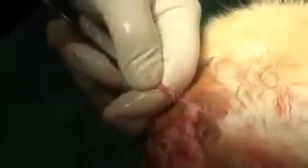And then I'll cut, and then it kind of forms the knot. This starts the starting of the knot. So then I'll cut the testicle off, and I'll put that blade away, and then we want to bring the loop above the cord, above the instrument, and it ties down on the cord. So we make it nice and tight so it doesn't bleed, and then I'll take the blade and cut the rest off. So now you'd say, gosh, what's going to happen to those wounds? Well, they heal up just fine.